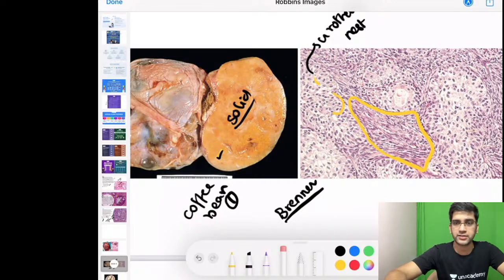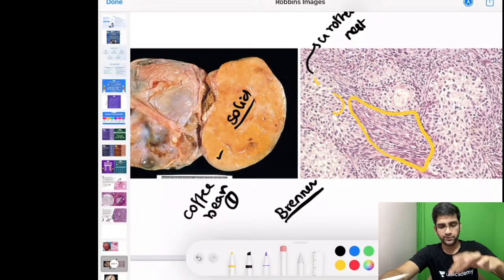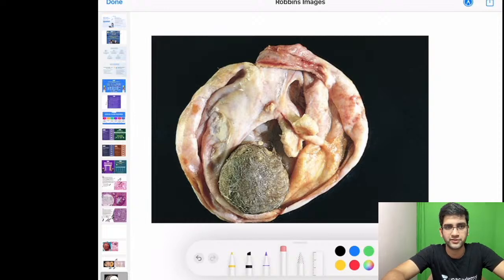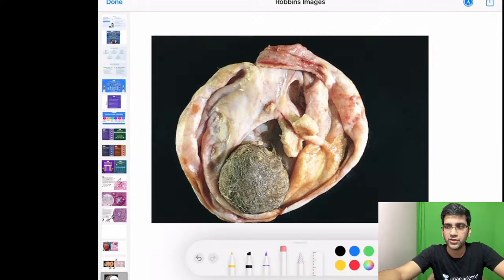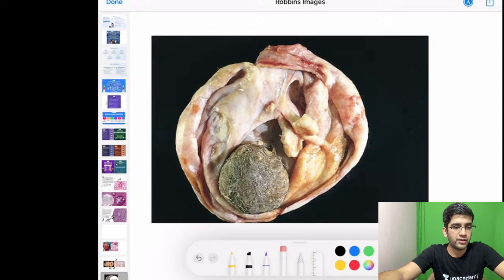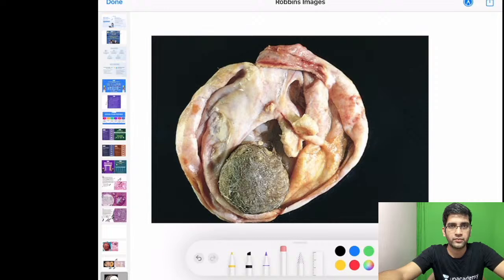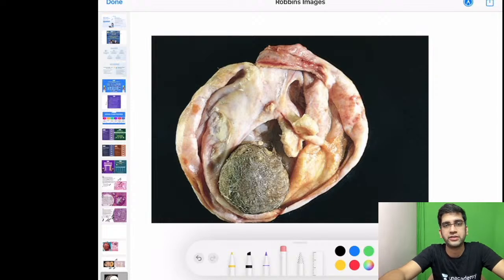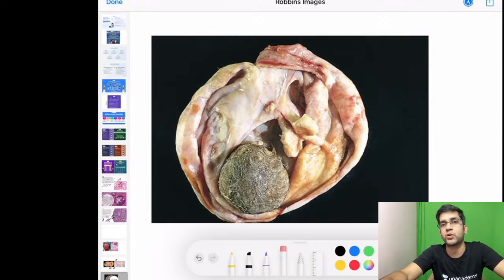The next image is a spotter — classical teratoma. Teratomas in women are most likely benign: mature cystic teratoma. Microscopically, teratomas can be mature, immature, or malignant. To classify something as an immature teratoma, the characteristic finding required is primitive neuroepithelium.